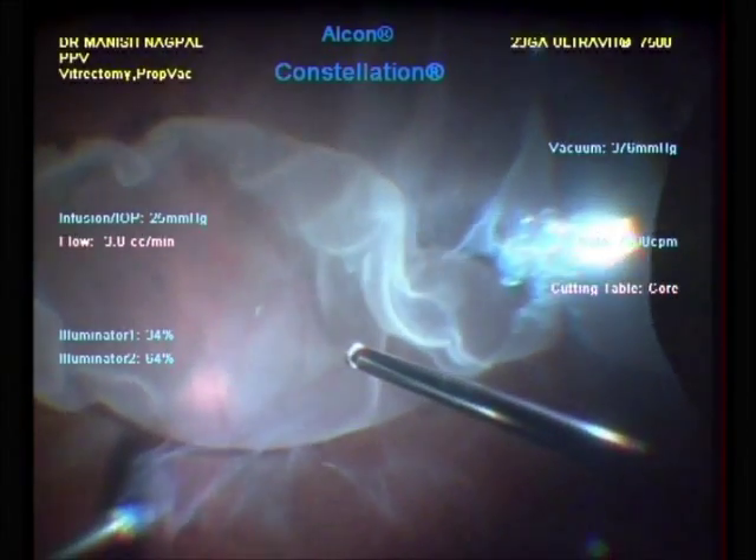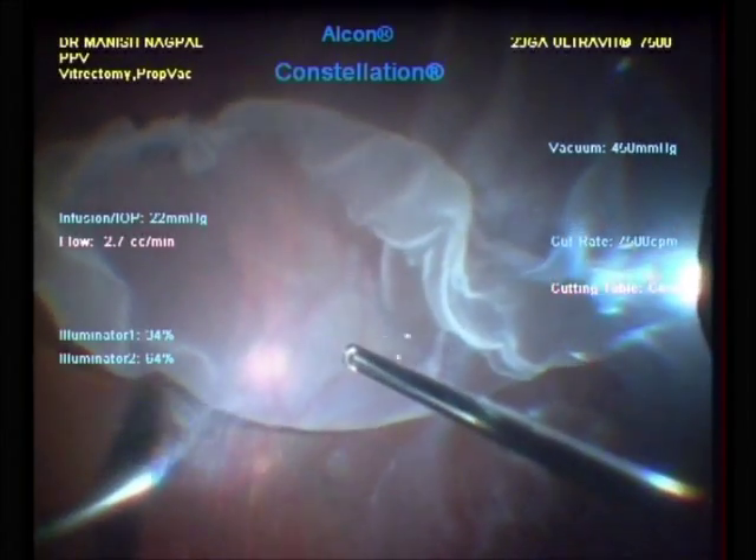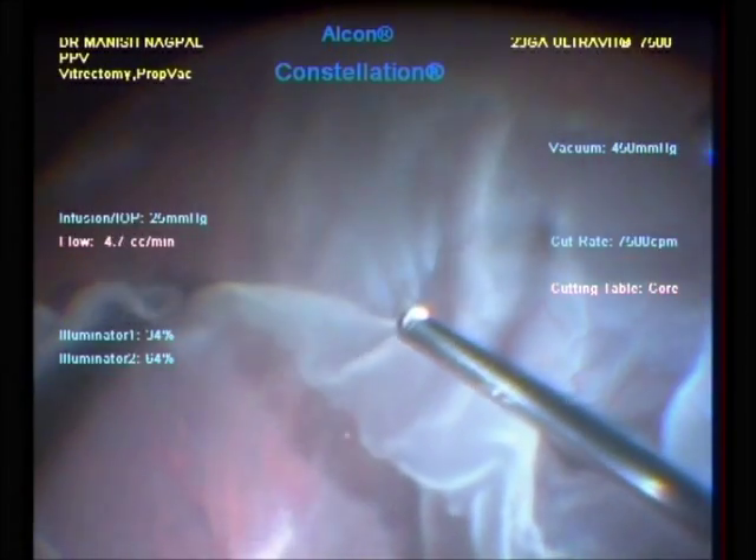Present settings are at a cut rate of 7500 at the core mode of duty cycle, which means that the port open time of the cutter is longer and is useful for clearing up the core vitreous.